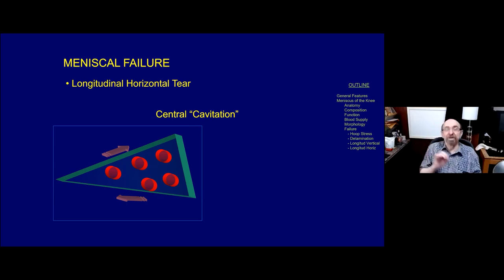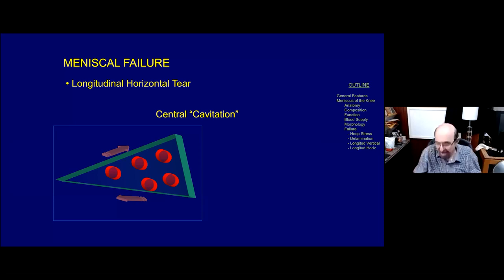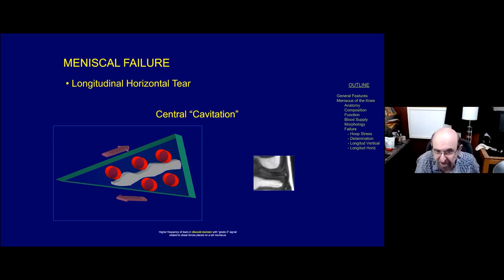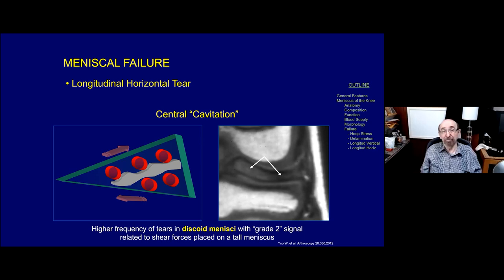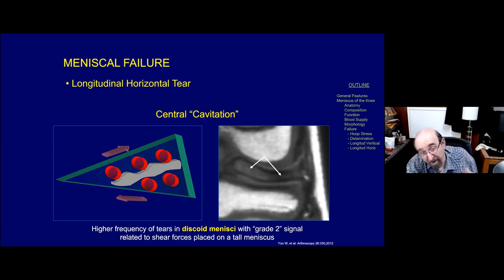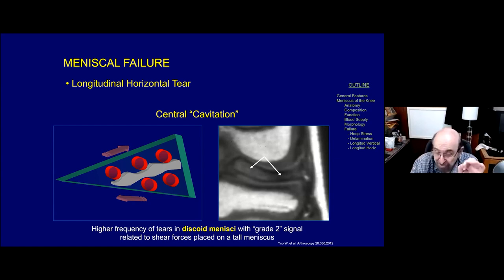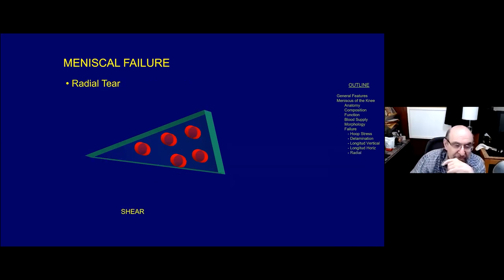If you have a tall meniscus - think of a discoid meniscus - shear forces can be extensive. A pattern seen particularly in a discoid meniscus is known as central cavitation. So our criteria change: when we have a discoid meniscus with a lot of gray signal, even if it doesn't violate the surface of the meniscus, it is often found to be cavitary at arthroscopy - this is intra-meniscal tearing. The patterns of failure in a discoid meniscus are very different from those in a non-discoid meniscus.